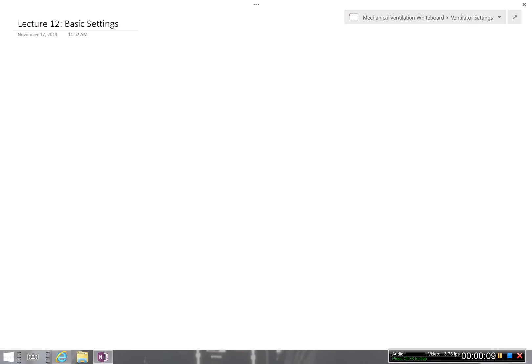Today we're going to discuss mechanical ventilation whiteboard ventilator settings. I want to go over some basic settings. We've talked on the ventilator suit matrix about all the different types of modes of ventilation, and today I'm going to cover how you would set up each one of these particular modes, what things you're supposed to be looking for, and some basic settings that would be appropriate. It's one thing to show you on a whiteboard, but it's another thing to show you on an actual ventilator, so today I'm going to take a road trip to a ventilator simulator available online.